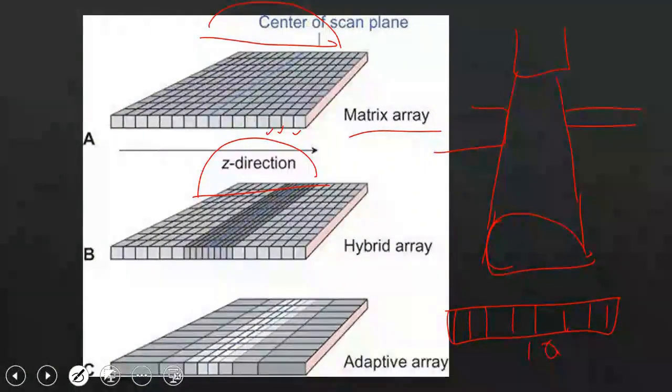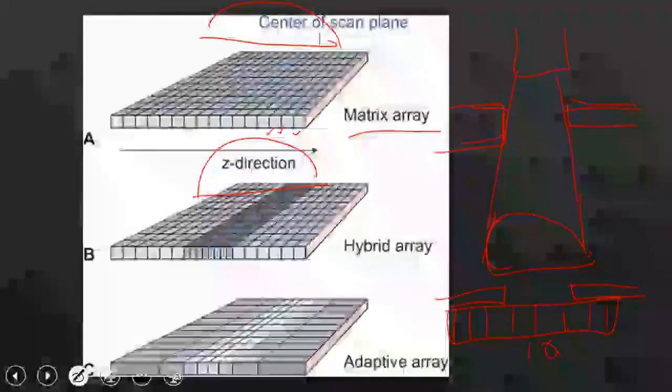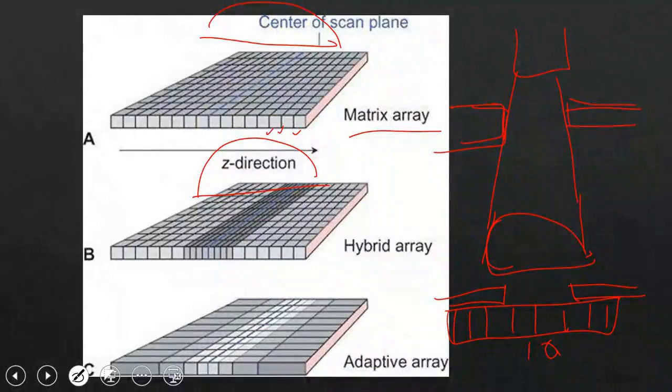Should I change the beam width from the collimator above, or should I change the post collimator? The beam width here will not change for you, but I change the post collimator. Why? Because I want to take a specific thickness, which is exactly what I need in this particular context.